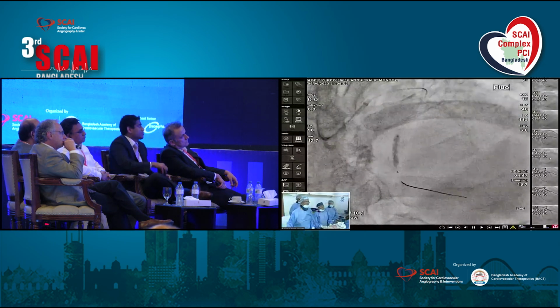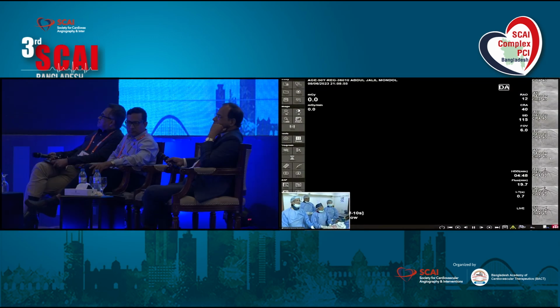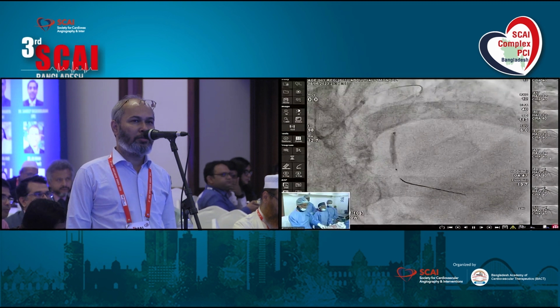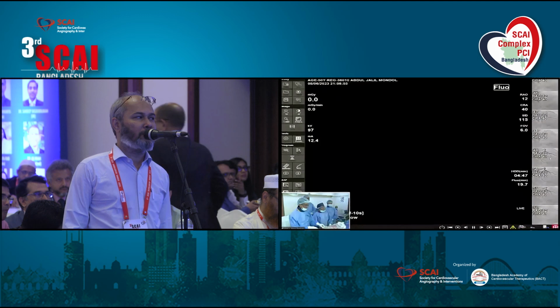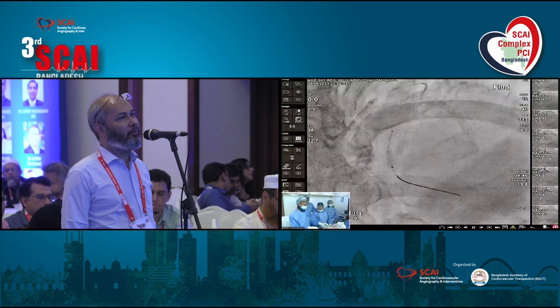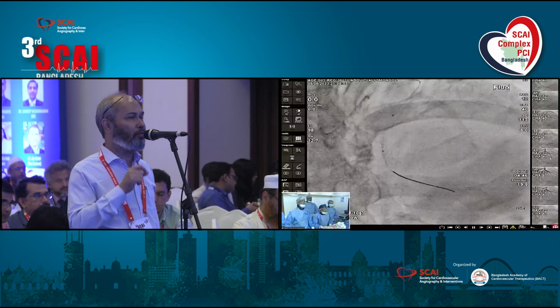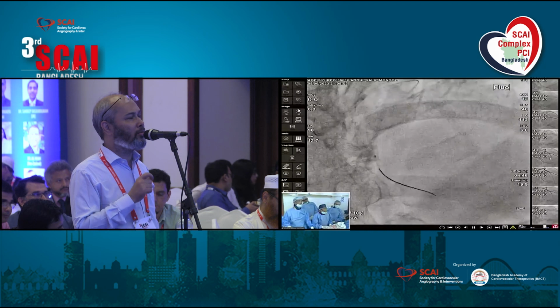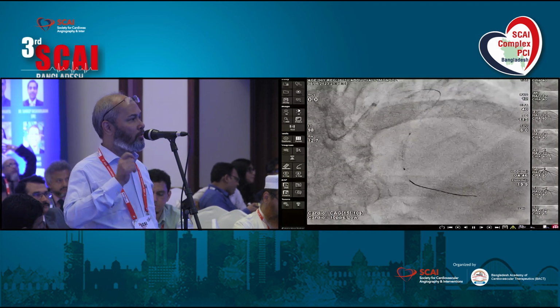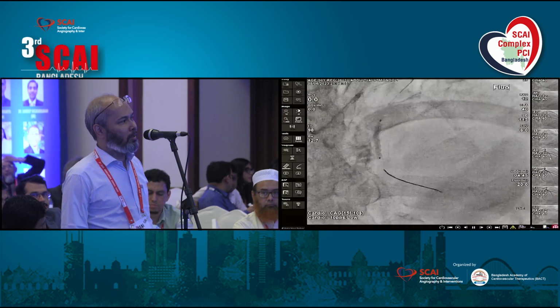Yes, nominal. What about the type of balloon, NC balloon or drug-coated balloon? If you use a drug-coated balloon especially, you should inflate at least 60 seconds, 45 seconds at least. And if you think this is a really tight, very critical lesion, if you use the NC balloon, definitely you should go for at least 30 seconds. But a Japanese study shows three consecutive inflations give a better result.